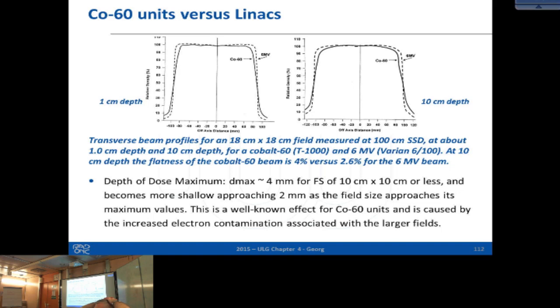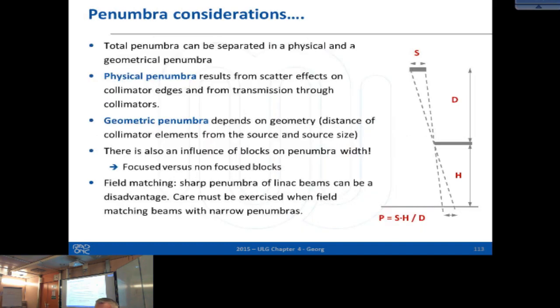Another question: how fast is the temporal resolution, and the ratio between being able to rotate the patient, being able to move the patient, and being able to make a shutter of the cobalt? So could you fractionate really in... No, I mean that needs to be done with the collimators, yeah, with the multi-leaf collimators, because I never thought about that actually.